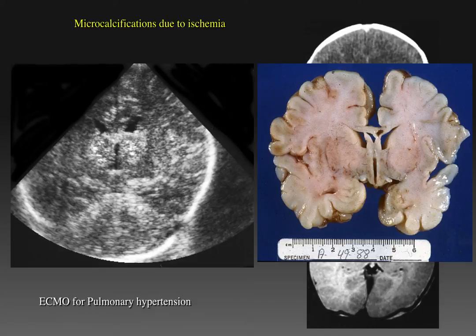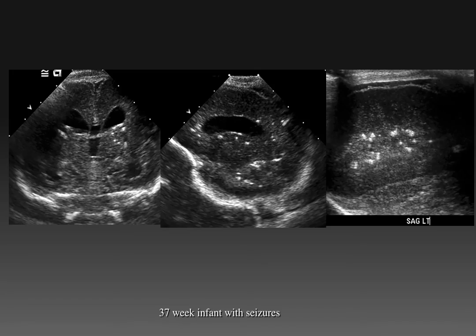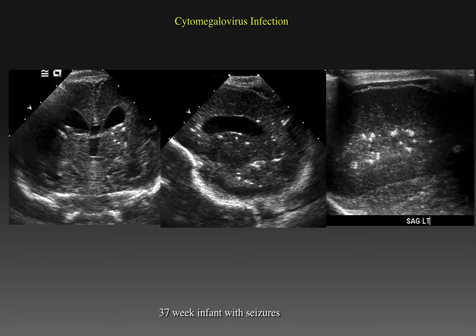Microcalcifications can occur secondary to ischemia after one to several weeks post-insult and can result in diffuse and even focal echogenic lesions throughout the deep white matter. The other pattern of calcifications is seen in this child who is 37 weeks and presents with seizures. In addition to multiple coarse calcifications in the periventricular white matter, this infant has very limited sulcation despite being near term. This child had been infected with cytomegalovirus during pregnancy, and these focal calcifications represent secondary granuloma formation from the CMV infection.